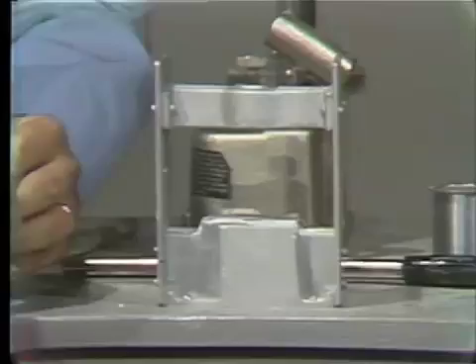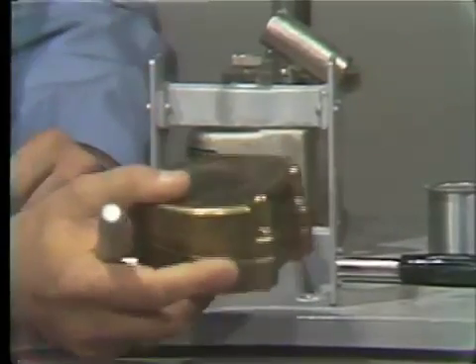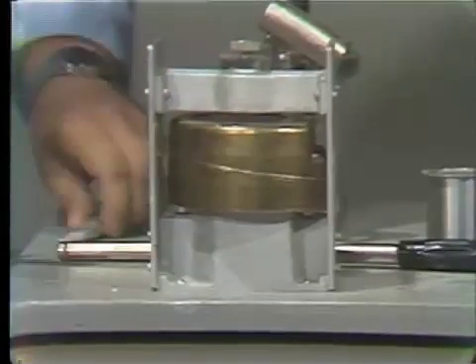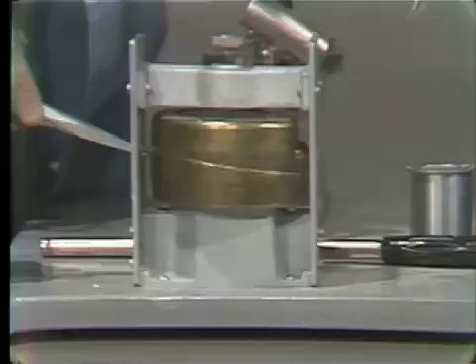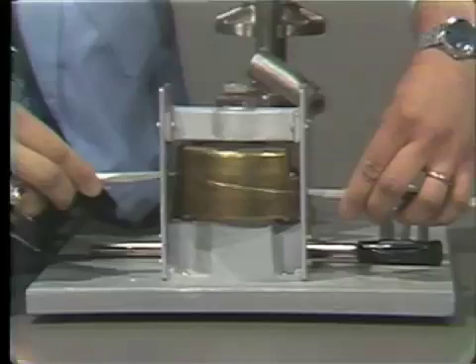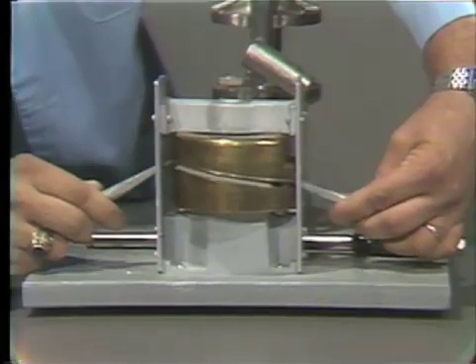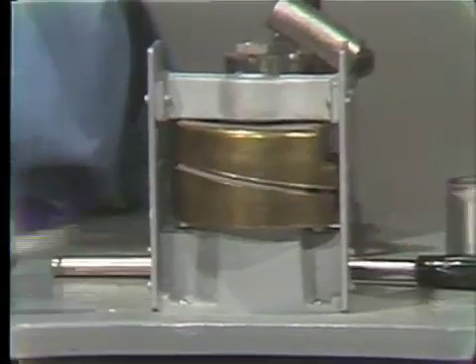To begin with, you place the bottom ring — the bottom of the flask — inside of the ejector. We use these large screwdriver-like devices to fit into the keys. And then you simply pry it. And as you see, the bottom half of the flask is separated from the flask.